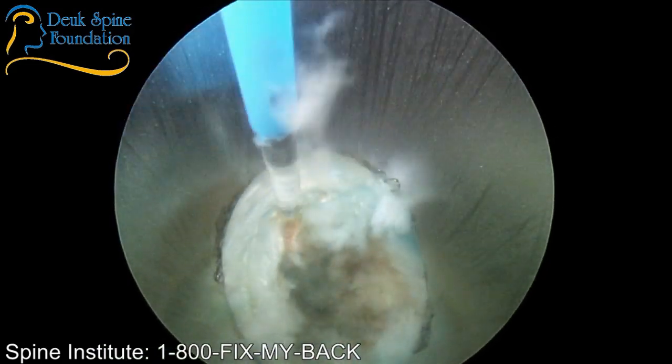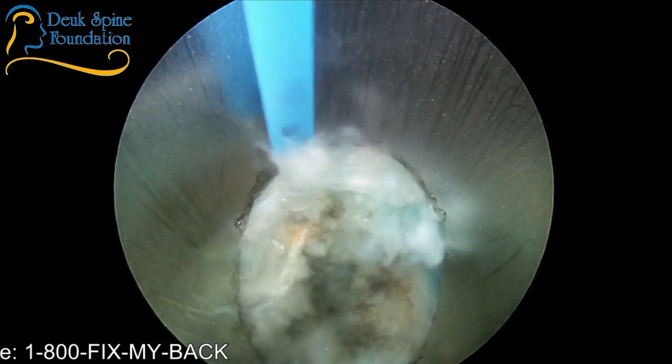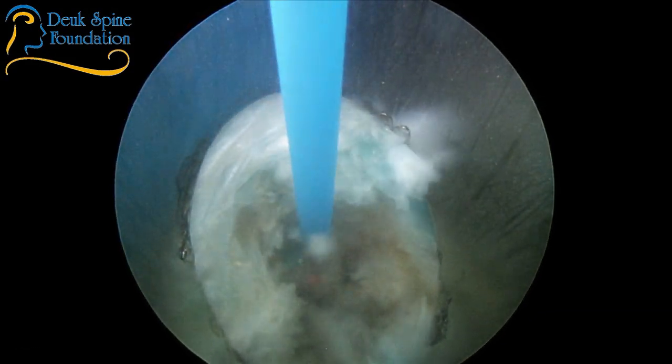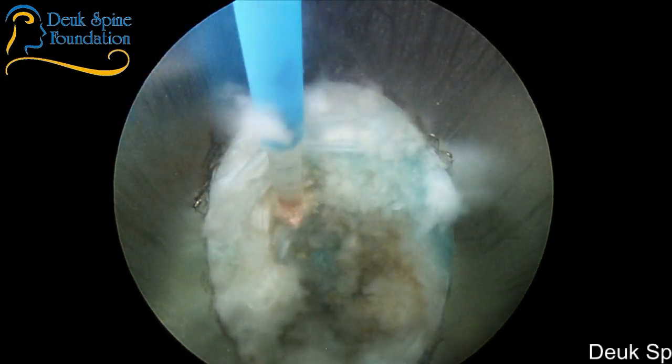All right, so this is the annular tear that I always talk about. It's like a little blue slice that just goes through and through, and it's very scarred up. And this right here is the interposed nucleus. This is the herniation. It's coming from the core out towards me. And I got to zap it away so the annulus can heal.